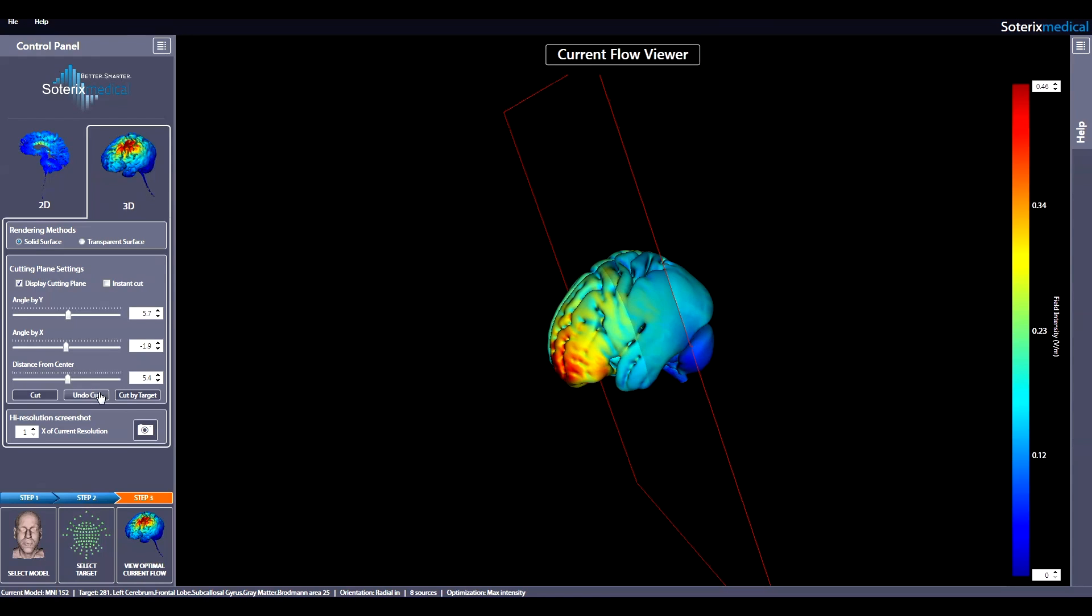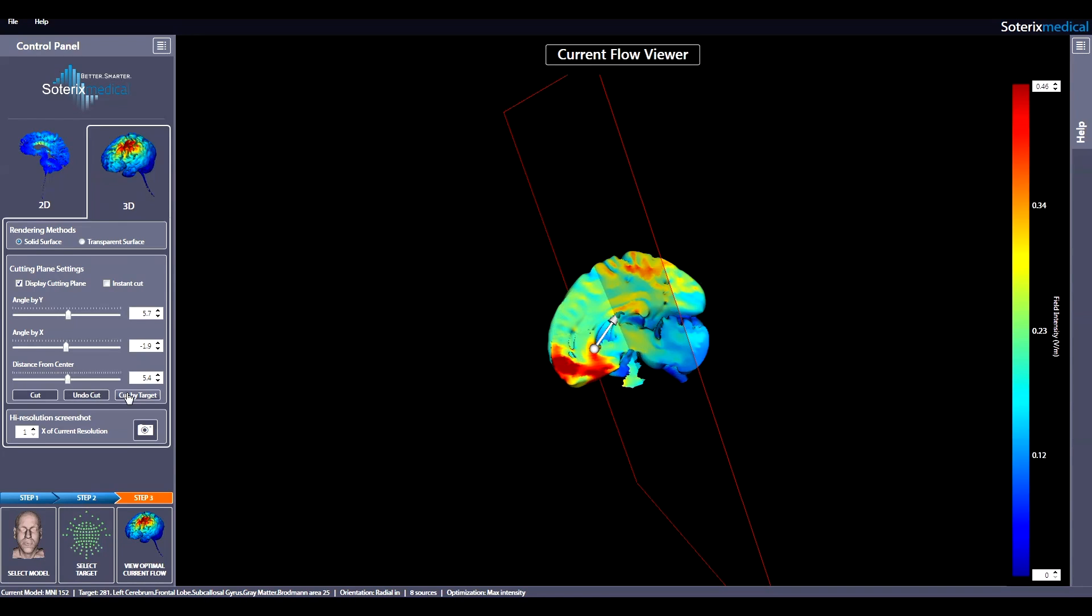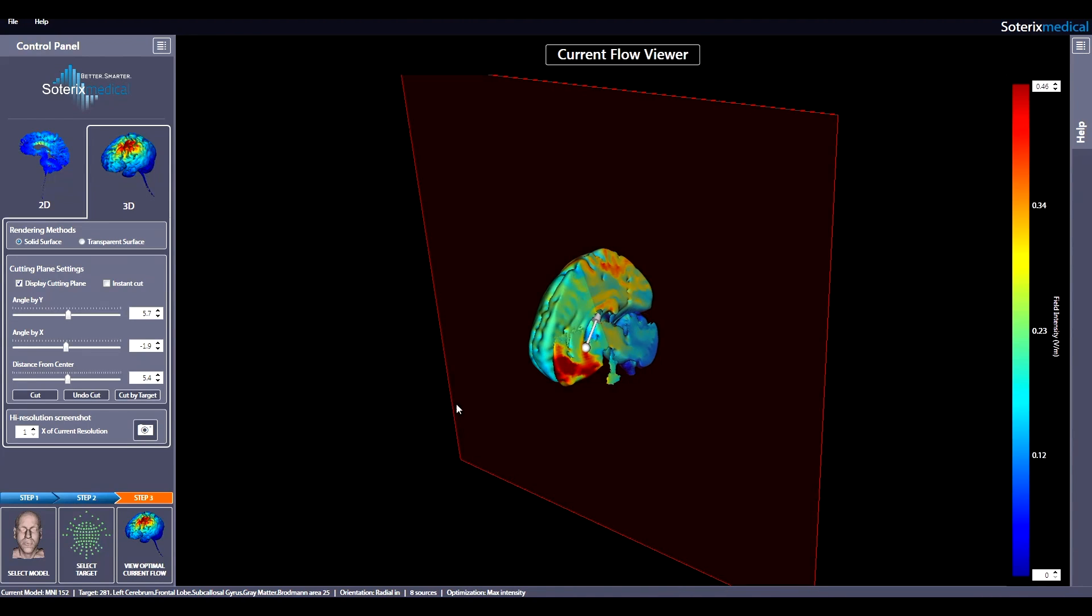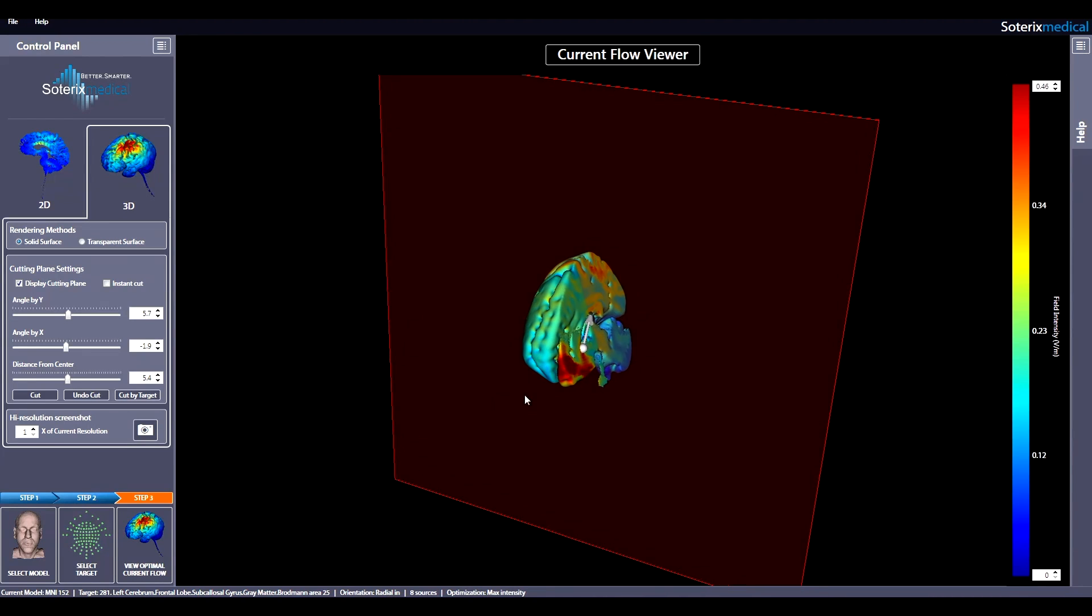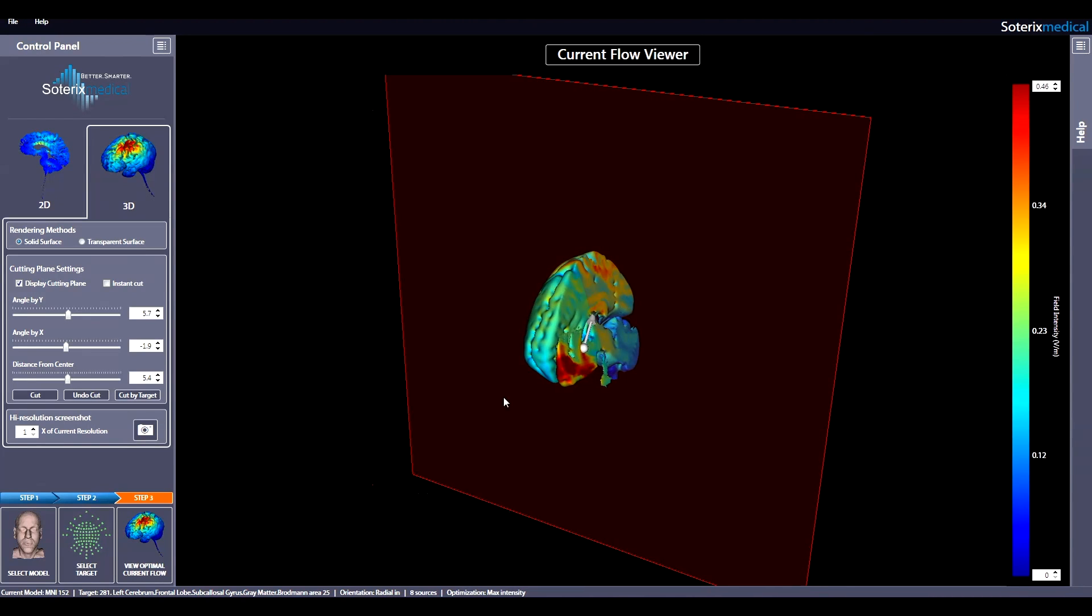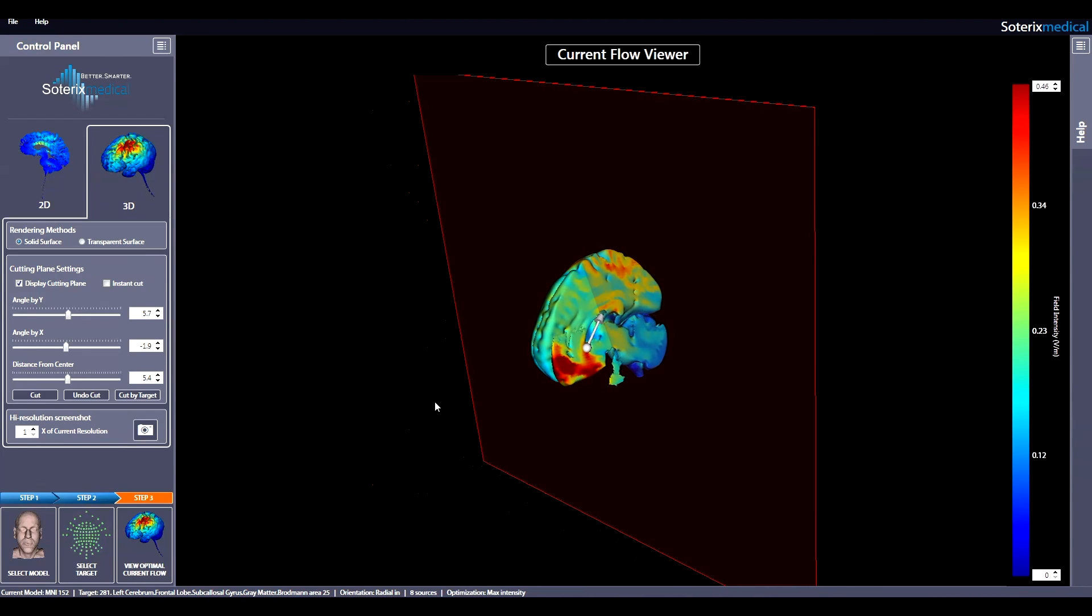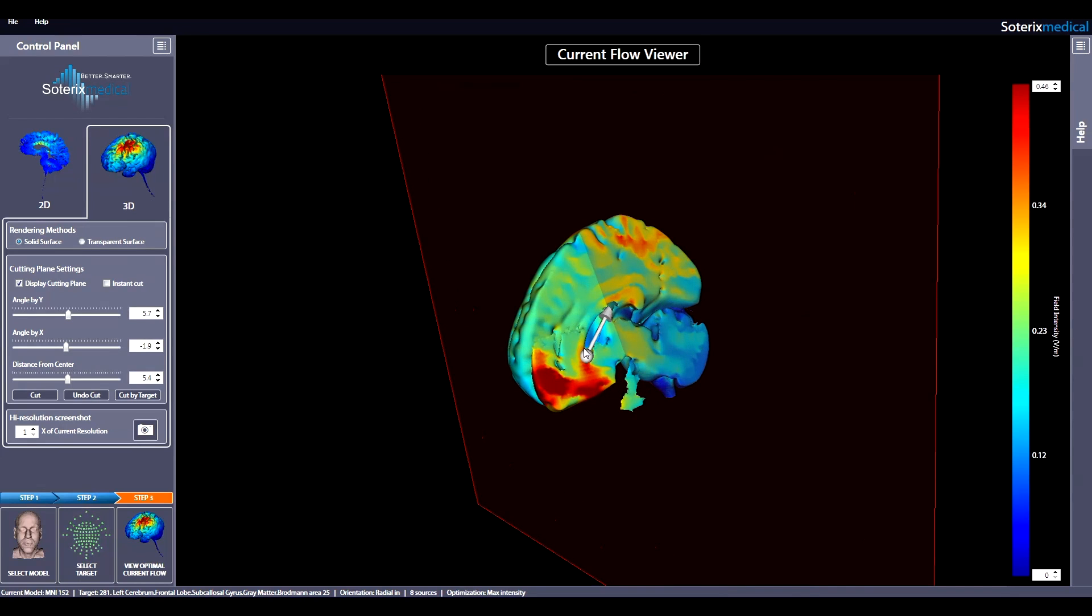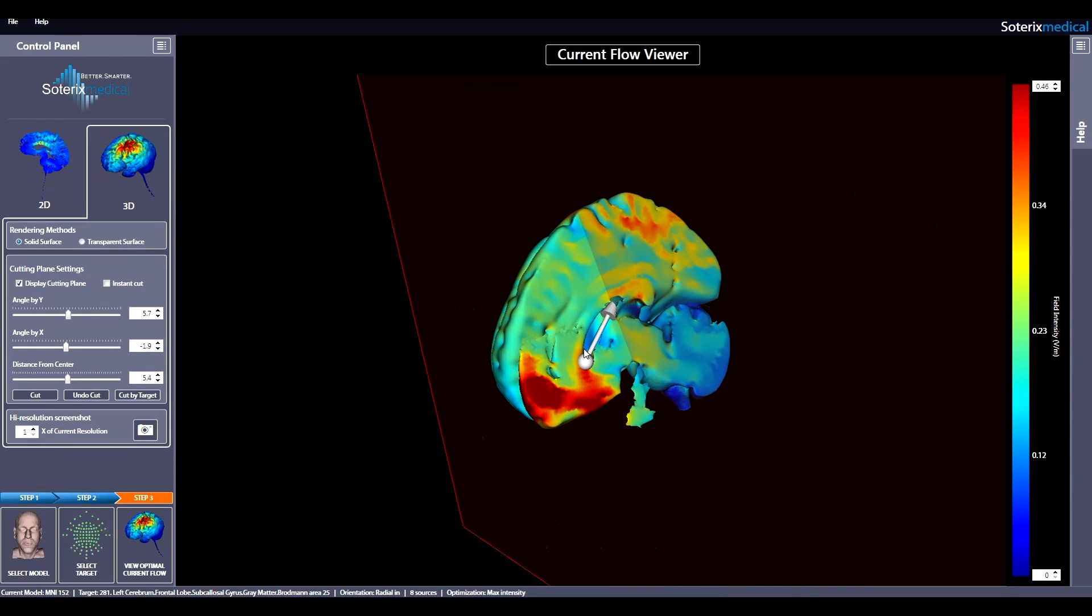By selecting Cut by Target, the plane will cut the head volume at the location of chosen target in Step 2. The white sphere will show the location while the arrows show the selected field orientation. The field intensity scale can also be adjusted here in the same way as the 2D view.